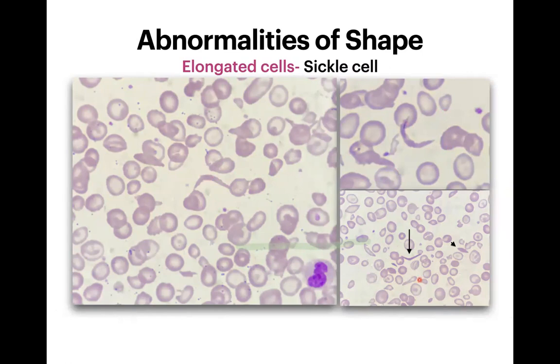This is the image I have shown previously also in schistocytes. This one was a linear fragment, and here you are seeing a boat cell. Okay, so see, the ends are like cut from both sides. So these are again highly suggestive, but not diagnostic. And see, there are many target cells in the background of these cells. One is here, here. Many target cells are there. So this was taken from a case of sickle cell anemia.